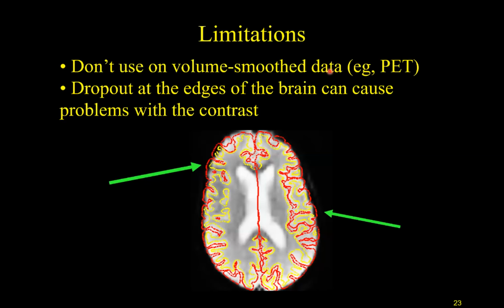But I also do a lot of PET research, and I was quite shocked to see that certain biases can creep into the registration when registering PET data to an anatomical, and this is because there's an interaction between the anatomy and spatial smoothing that can corrupt the signal. It's basically a partial volume effect, which I'll talk about this afternoon.